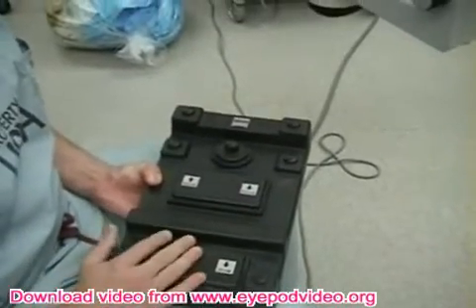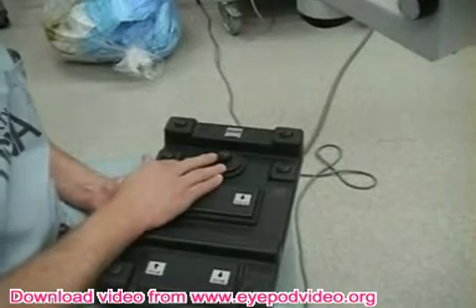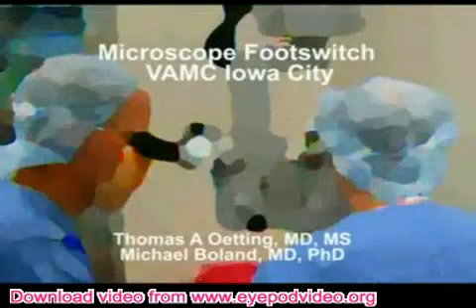These are the main ones you have to get used to: zoom up, zoom down, focus up, focus down, and left/right with the center of the microscope. Thank you.